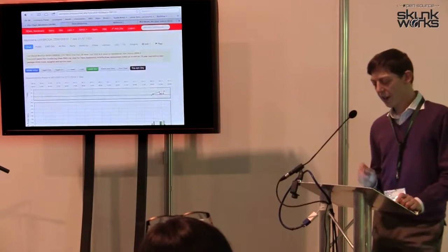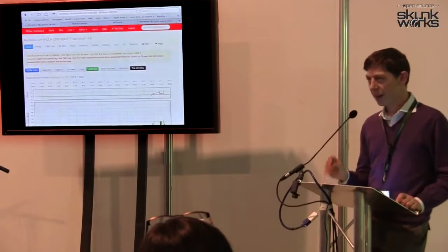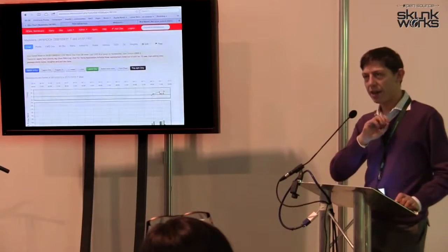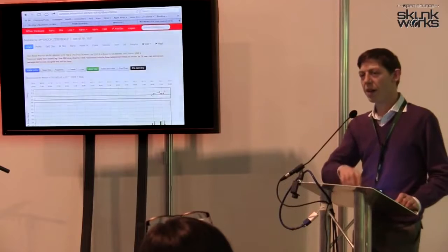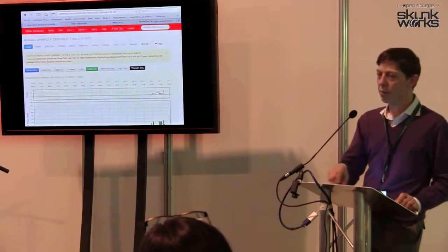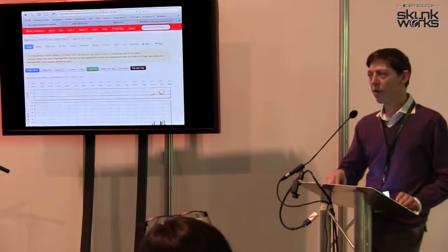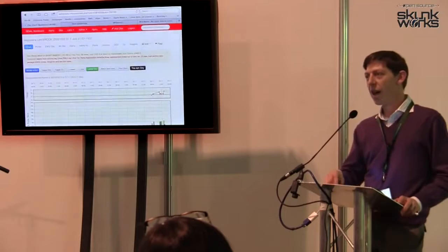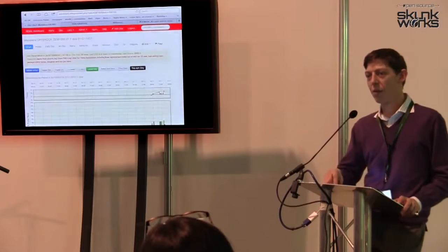I think one of the things that I'm particularly pleased with WardWare is that it's been able to expose aspects of variance within a trust. When we've been rolling this out at King's, we've discovered that in some wards there have been 3 or 4 different versions of the paper-based observation charts and the paper-based trust trigger policies.